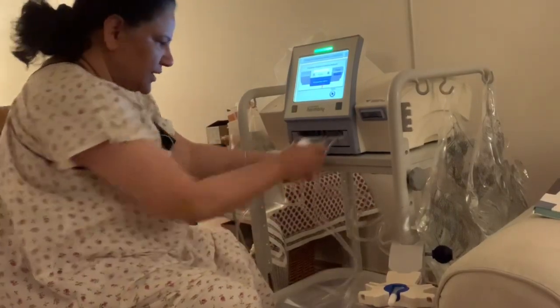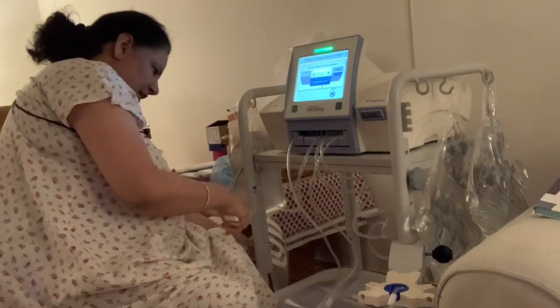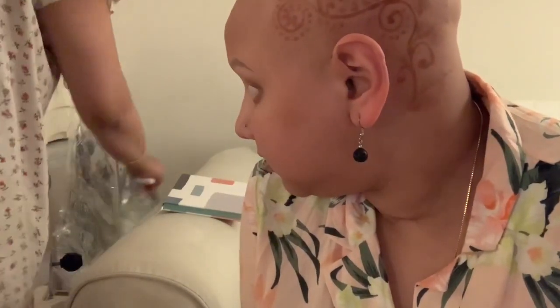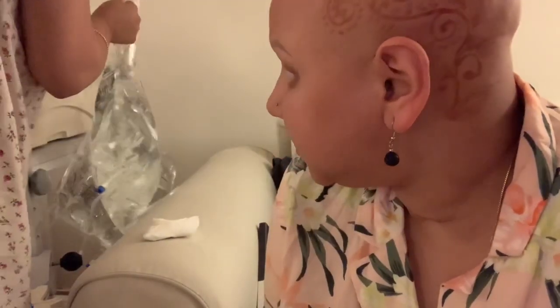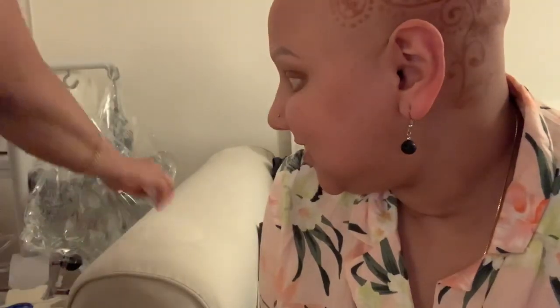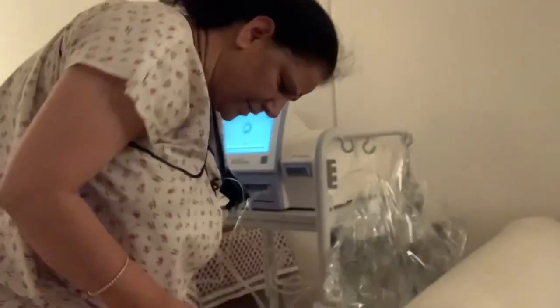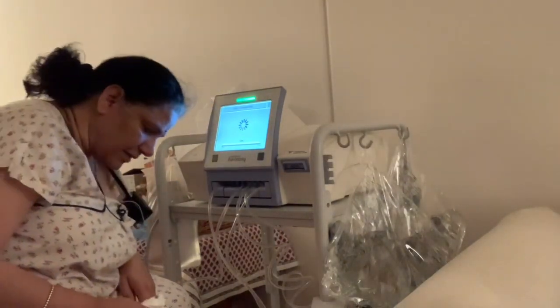The machine says something about the wires not being proper, so I need to check that they're all okay and nothing is bending too much, because that will hinder it. The bags are super heavy — five liters each. It indicates if something is incorrect, which is really nice.